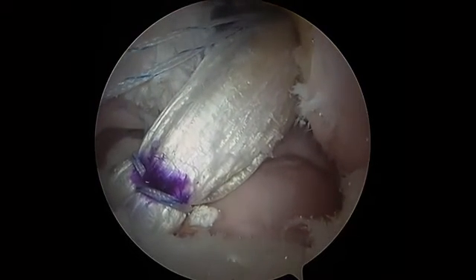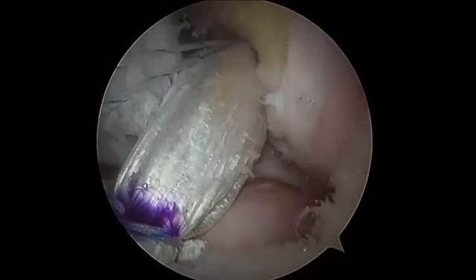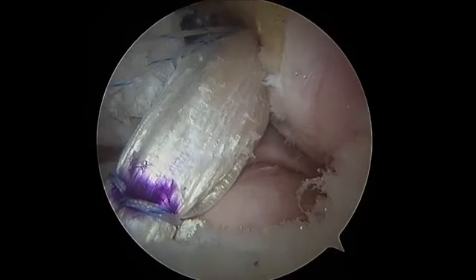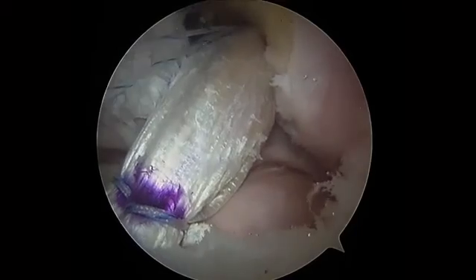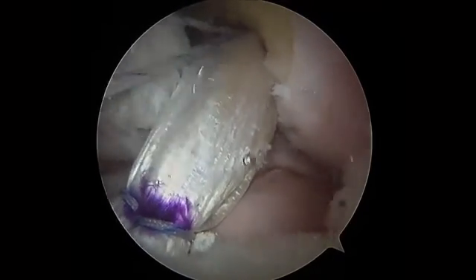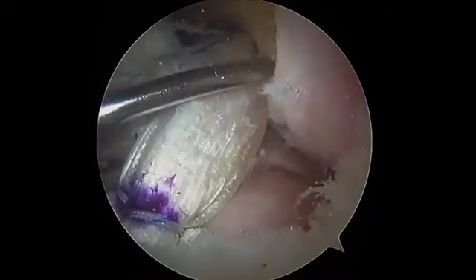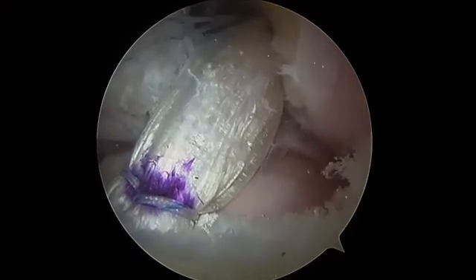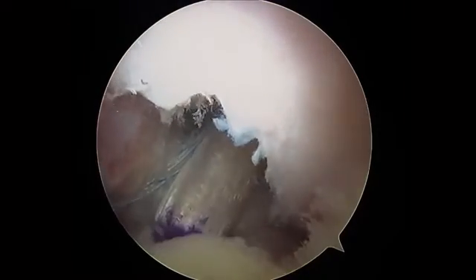So we know that we've created an isometric graft. We can predict that this graft is going to see low tension through the range of motion. We see very little impingement or no impingement as we bring the knee through a range of motion. I will often look at whether the graft gets abraded to see whether it's going to impinge on the lateral wall or on the roof. And as you can see, as we bring the knee through a range of motion, there's no impingement.